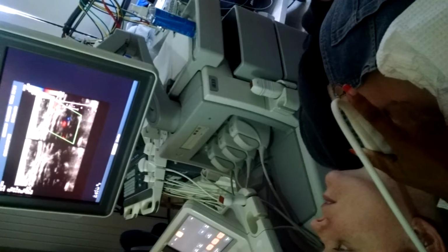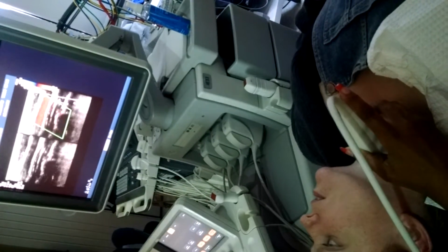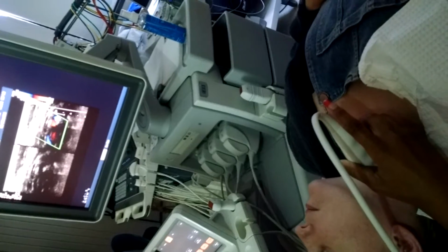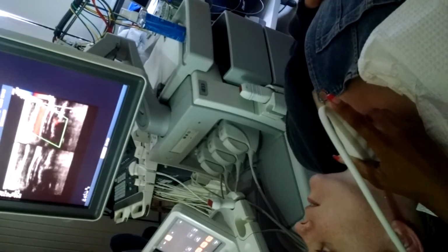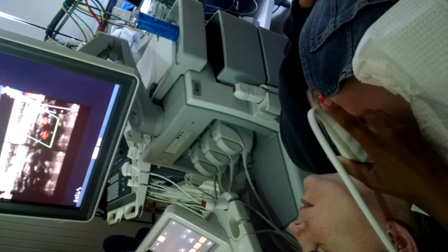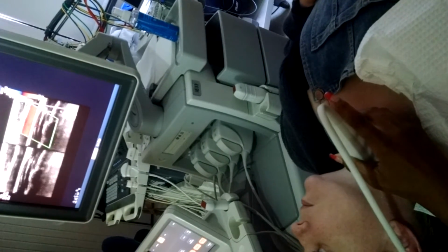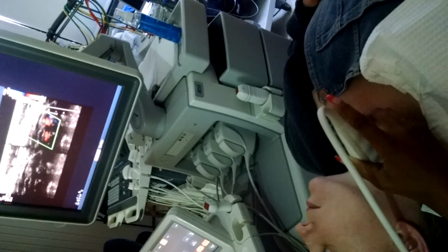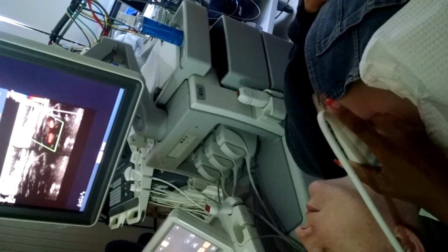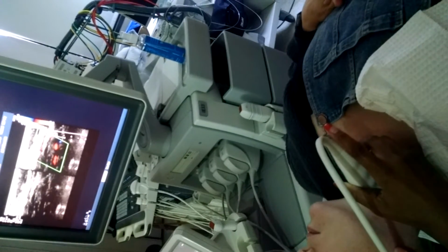So there's the vertebral. And you can see the common above it for reference that the flow is going in the same direction. Right. So we have vertebral vein and artery. The artery's pulsating in red, the vein is in blue. There's the common, so that's the flow direction. The anterior approach is usually a lot nicer to get those vertebrals.